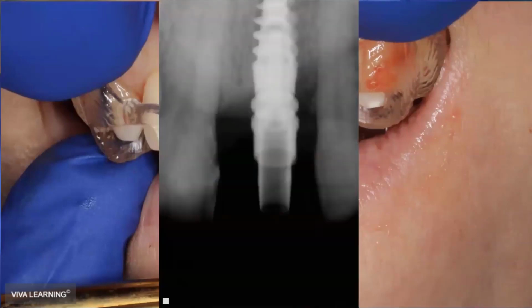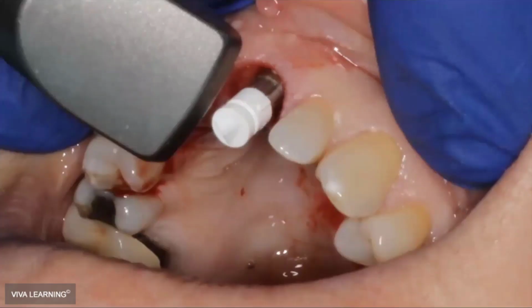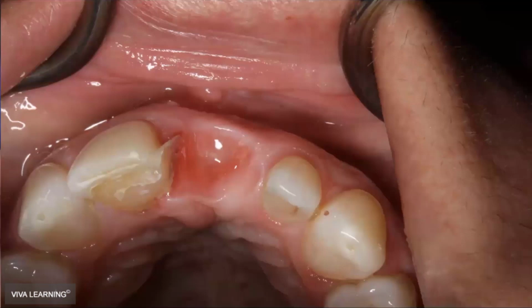So here we see same day scan post. The implant torqued in, so I'm feeling pretty good about it. I put my CEREC scan post in there. I go ahead and do my scanning, and then we see her again in 3 to 4 months.